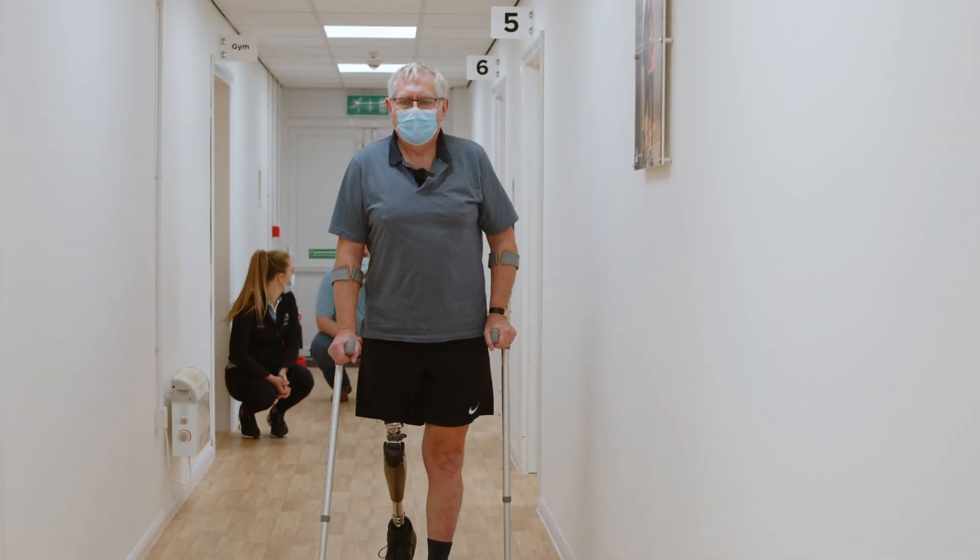My foot was where it would have been before I lost my leg. It just makes a lot of difference. I could turn corners easier, which to someone who's got two legs doesn't sound a lot, but when you've only got one leg and you're in a socket, it takes about six steps to turn round and go back where you just came from. I'm thrilled to be without the socket now, not least because I haven't got the dinosaur skin I had with the socket.